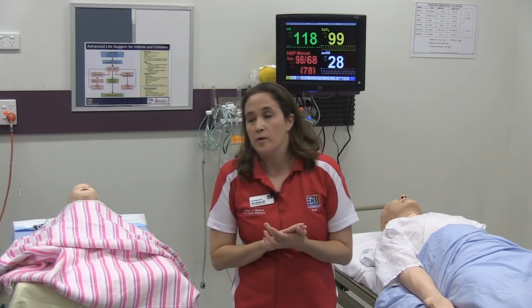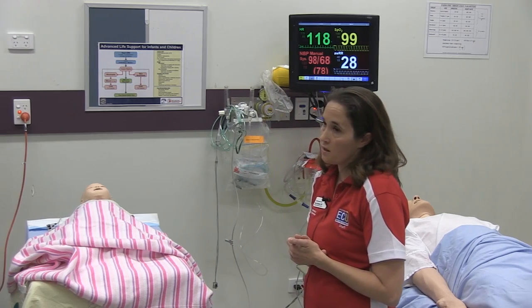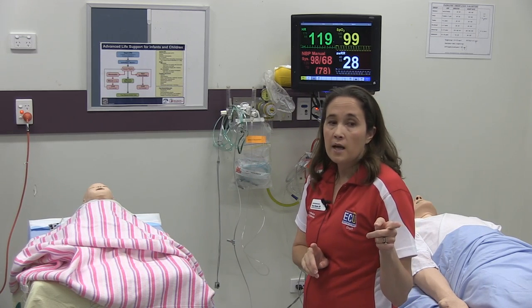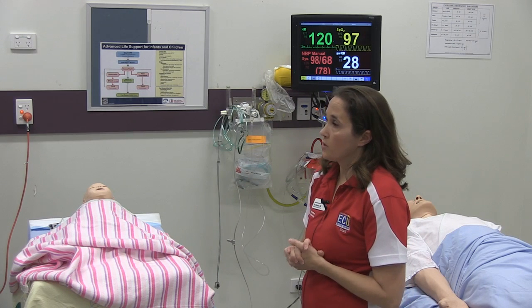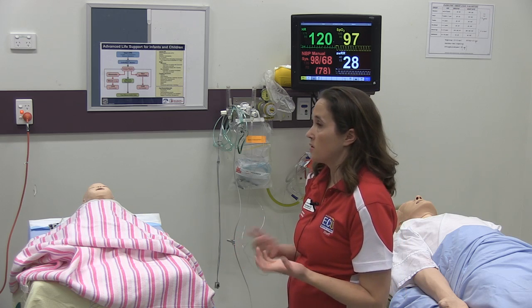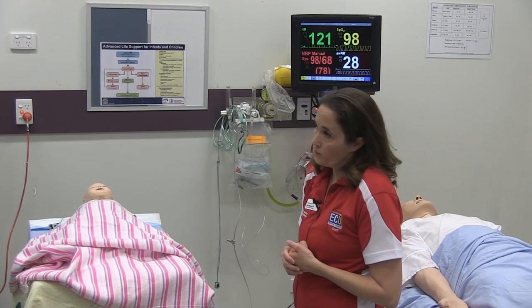We also have the ability to have live phones in our simulation suites at our center. By live phone, it means that there's actually a number that you dial and it gets to the control room. And so we orient them to how to use the phone to call for help that way. We also let them know that there are Confederates in the room.